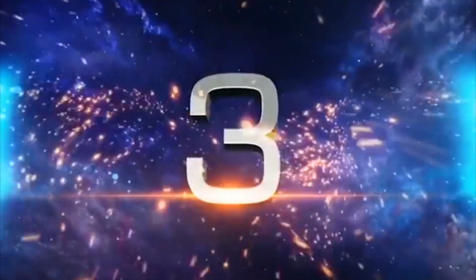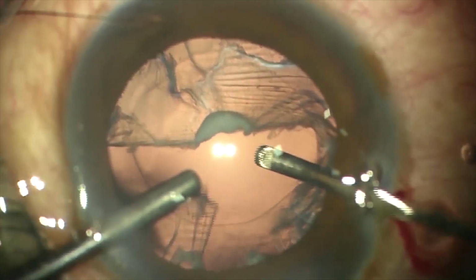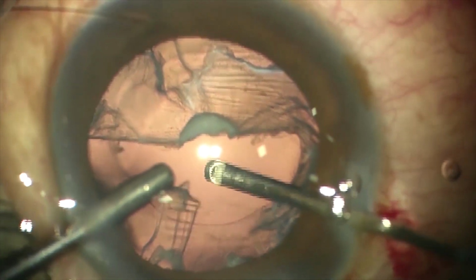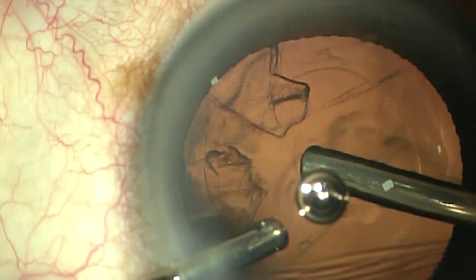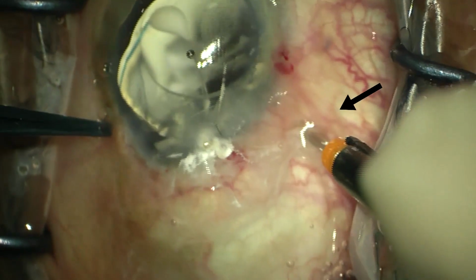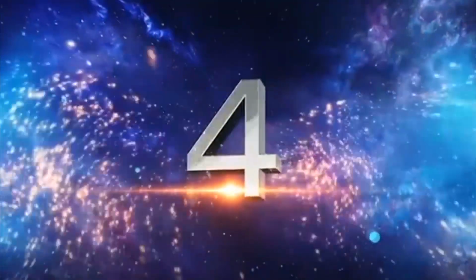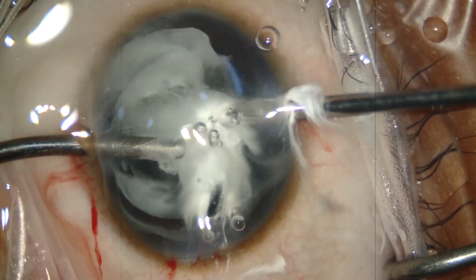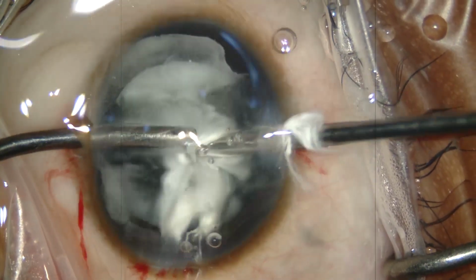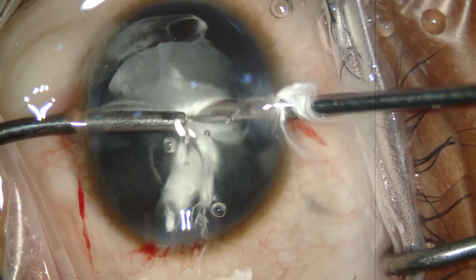Number 3 is using either a pars plana route or a limbal route. The limbal anterior vitrectomy can be done using 2 separate ports and avoiding the main port, or alternatively, a pars plana anterior vitrectomy can be done. Number 4, use of preservative-free triamcinolone to delineate the anterior vitreous and to facilitate the complete removal of vitreous either through the limbal or pars plana route.